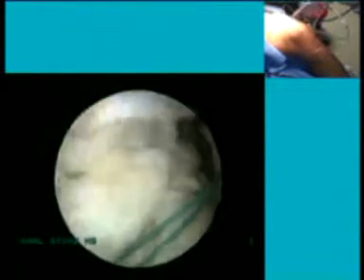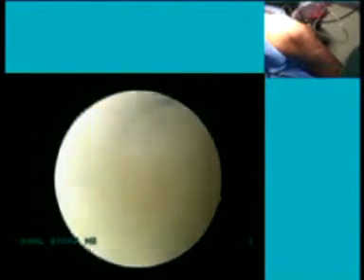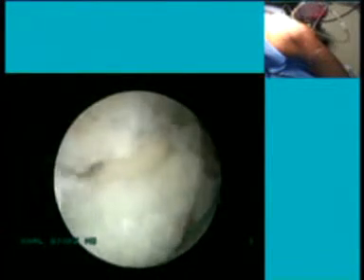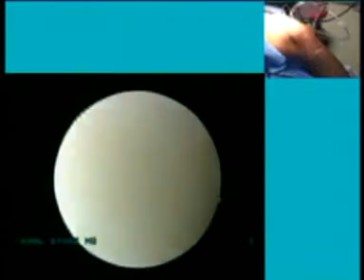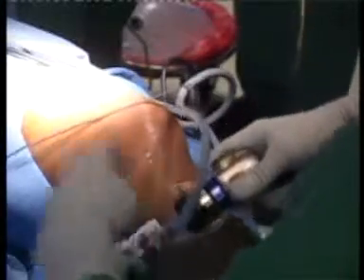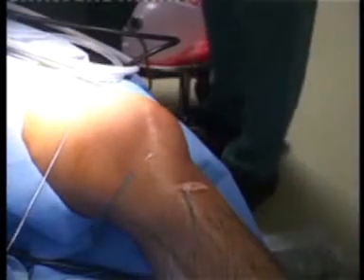Bone grafting, you have to be very careful. What I do is use those different diameter mosaicplasty cylindrical graft pegs, and I pack them there. I agree, it's very difficult. Sometimes you'll find that the peg is loose, but don't get scared. Pack them and wait for the healing. The healing takes a very long time. The MRI will show loose bone pieces in the tunnel. So I wait for more than 4 or 5 months, and then I do the revision.